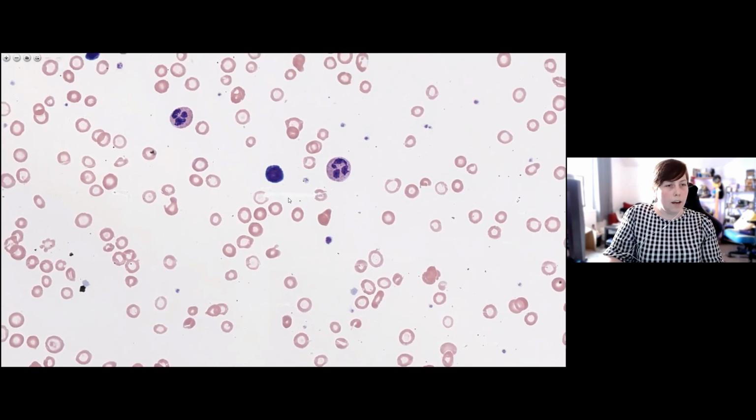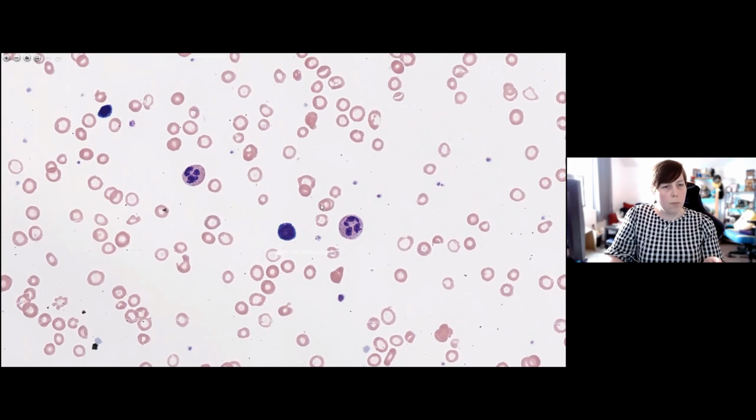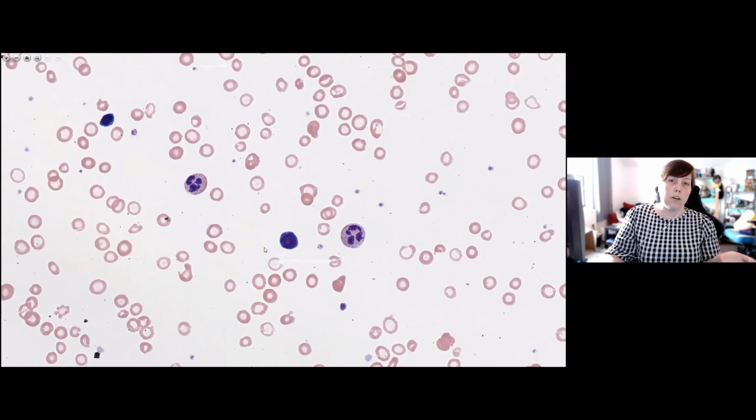Looking around here at this small lymphocyte and the red cells surrounding it, you can see this one here in particular is very, very small, much, much smaller than that nucleus is. There's a little bit of variation. These cells over here are probably a little bit bigger. These ones probably a little bit bigger, but overall they are smaller than that nucleus of the cell. They're all microcytic, but there is a little bit of what we call anisocytosis, which is variation in cell size. I would still classify all of them as microcytes though, which is important. The overall pattern of this film is one that I would call microcytic.